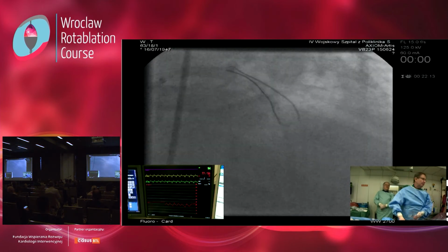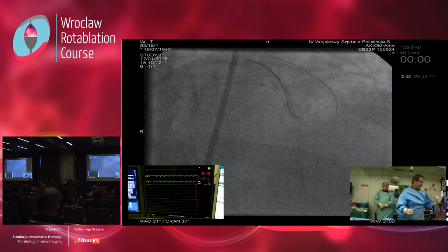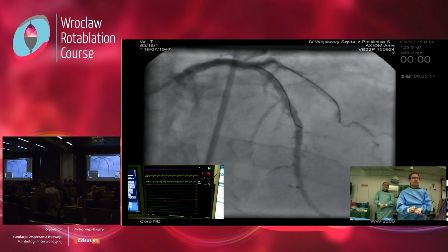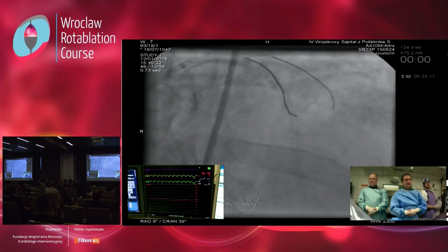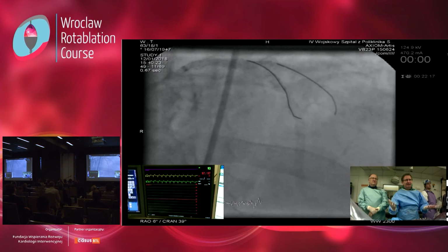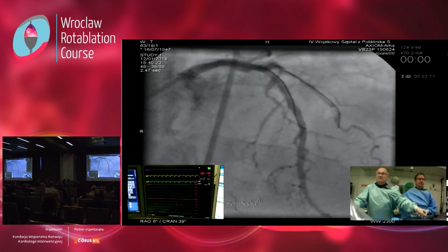Yeah, I do one more projection here, so we can see now maybe better LAD. You can just go back. So I think you see there's really diffusely diseased LAD. Even distally there's some stenosis. So, but for now, I would suggest to stop here.